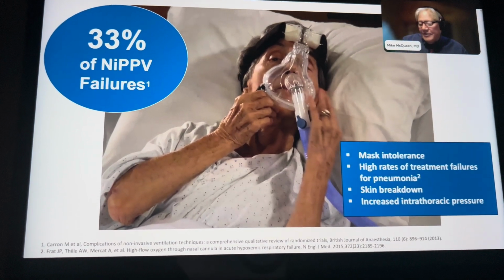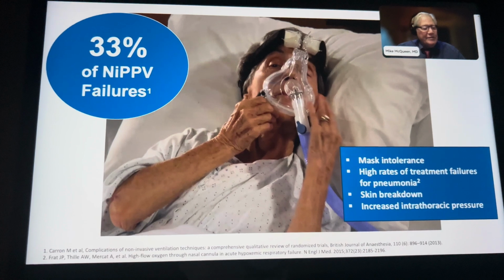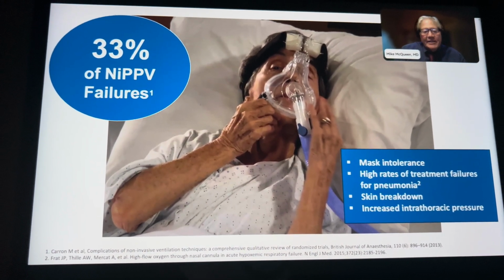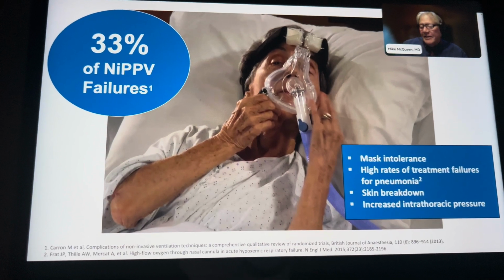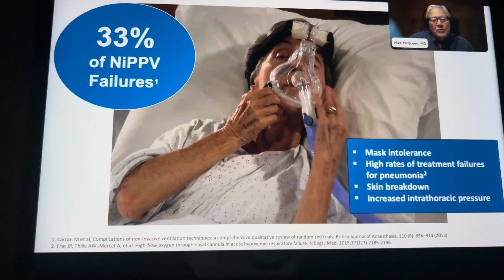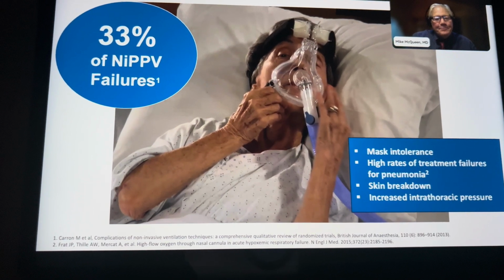Thank you for that background, Dr. Whittle, and I think your experience is similar to what we've heard from many of our colleagues, is that they thought, how can a nasal cannula possibly do this? So I understand the question that the HYPERACT trial was trying to answer. Can you walk us through the study design?